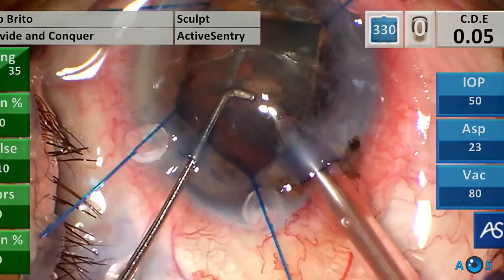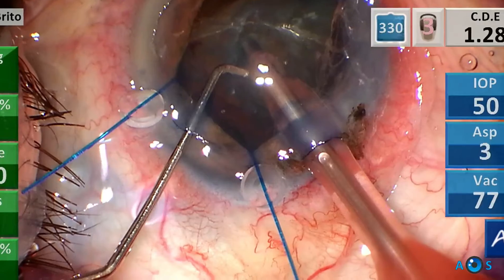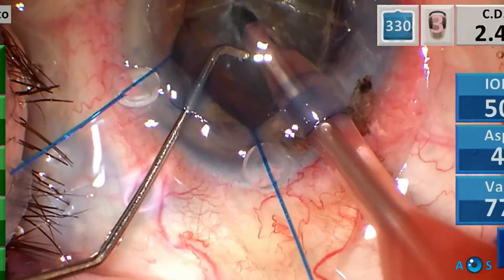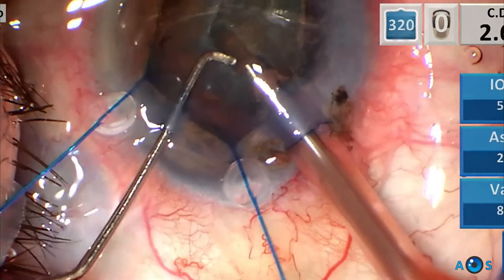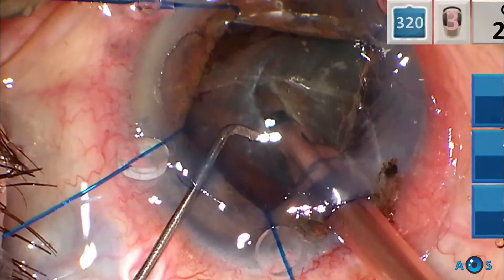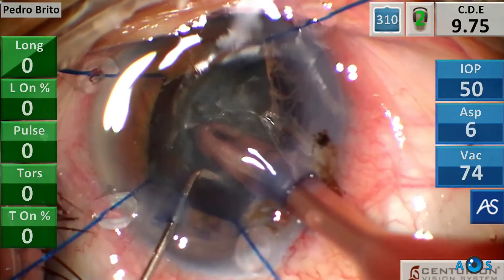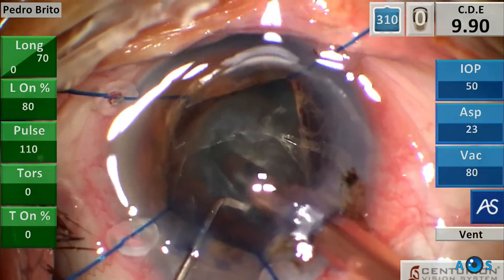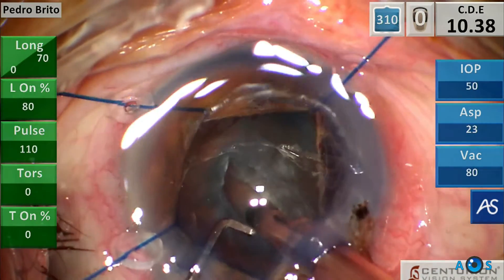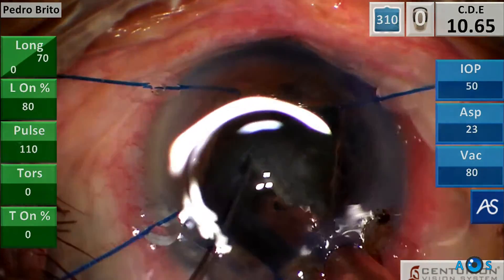Phaco emulsification has now commenced, and in these very dense cataracts it is wise to use the very reliable stop and chop technique, beginning with sculpting a very deep trench — typically aiming at about one and a half phaco needle width and two to three phaco needles depth. The surgeon may then opt to mechanically divide this trench as shown here, or even attempt to chop at the extremity of the trench.